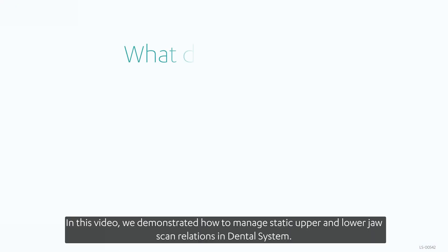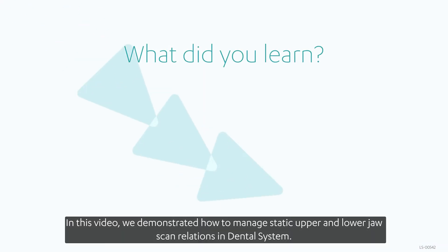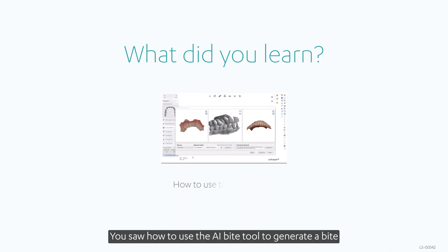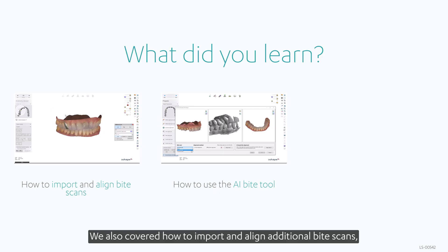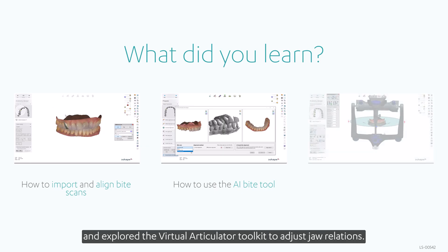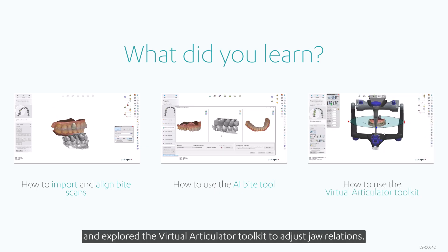In this video, we demonstrated how to manage static upper and lower jaw scan relations in Dental System. You saw how to use the AI bite tool to generate a bite when a registration is missing or potentially inaccurate. We also covered how to import and align additional bite scans and explored the Virtual Articulator toolkit to adjust jaw relations.